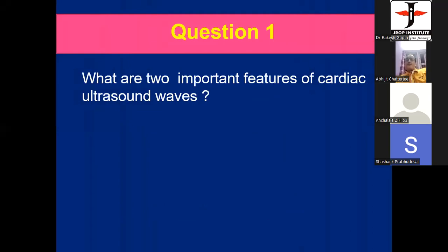Sure. Jaising, what are the two important features of cardiac ultrasound wave? Yes, sir. Good evening. Sound waves. Sir, I didn't get the question, sir. Two important features of cardiac ultrasound waves.